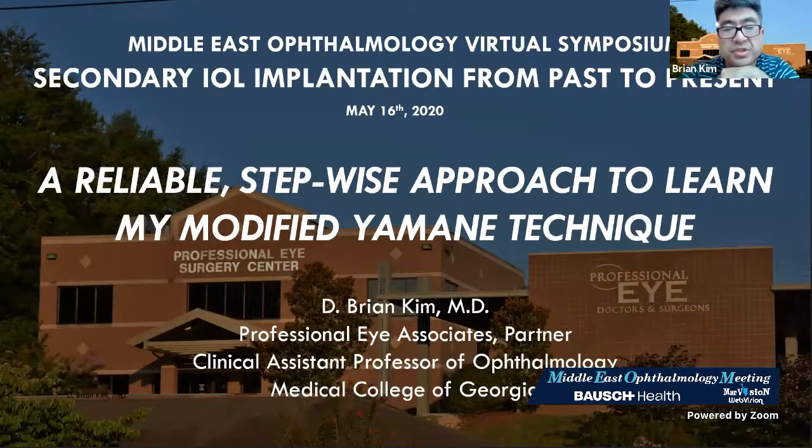That's just with experience, but I've seen some videos where doctors mark the needle with an ink pen 2 millimeters from the tip. My only concern is putting that ink into the vitreous space, but the few surgeons I talked to who did that said they didn't have any complications. So I think it's not a bad idea to ink it, but make sure the ink is dry before you place it into the vitreous space.